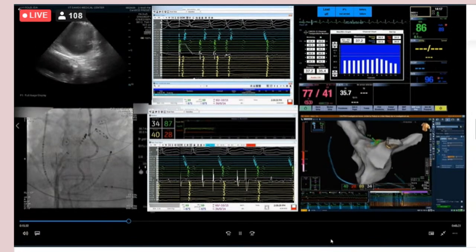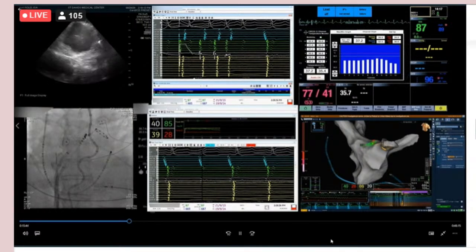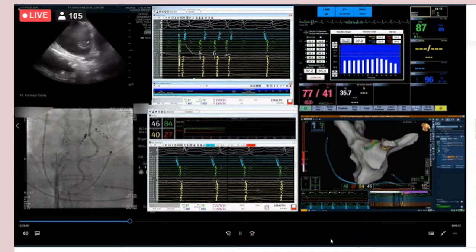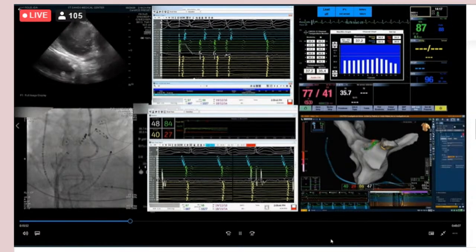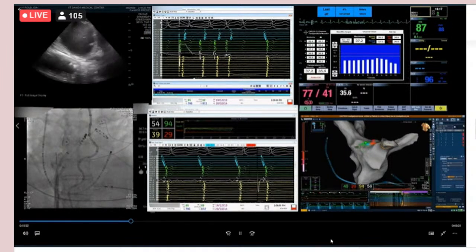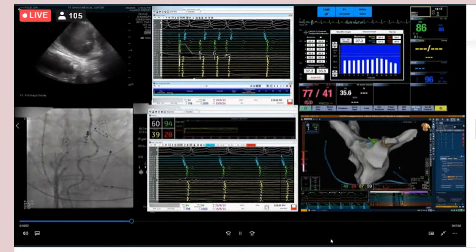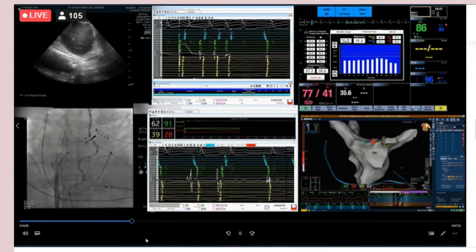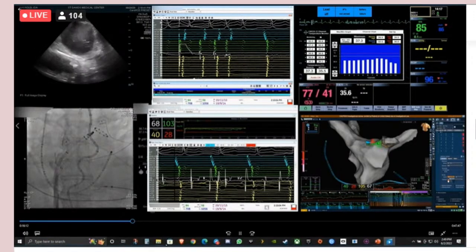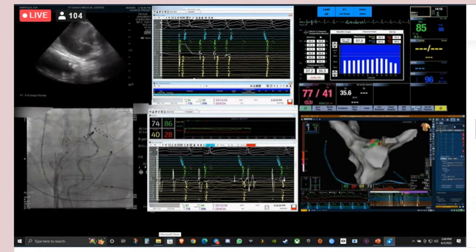That I like. The other thing I like about this catheter is the way it rolls is nice. So, for example, you can take it from posterior to anterior really smoothly, and it feels a little bit more like other catheters on the market that do that part well. You can see the arrow just switches to where you're pushing, and you can ablate really well. One of the problems with the Tacticath catheter is the amount of volume, in particular if you have to do a fair amount of ablation. So this actually eliminates that issue where you don't seem to have the same volume problem.